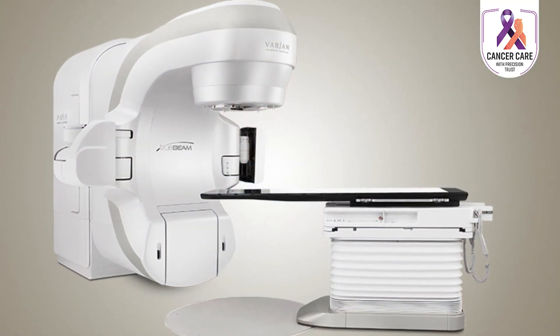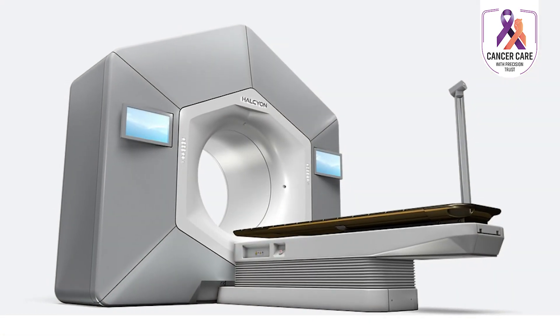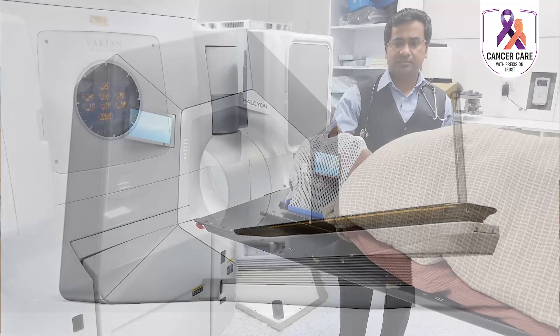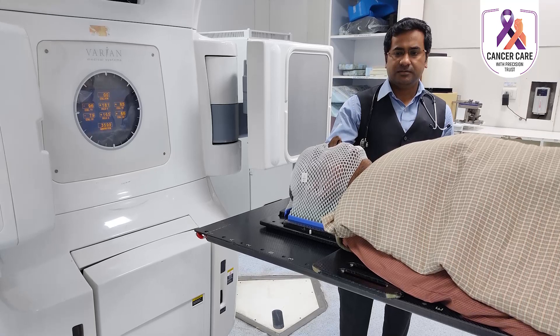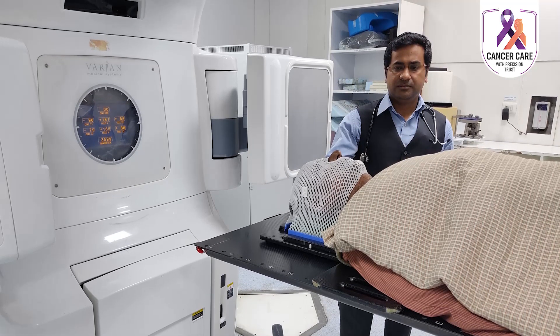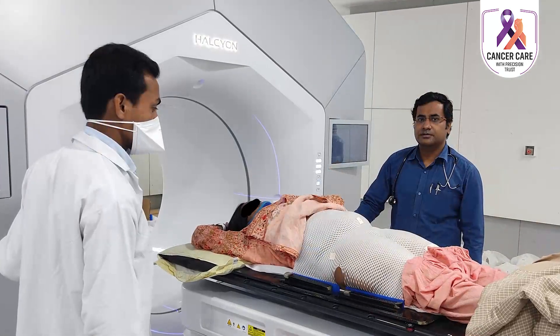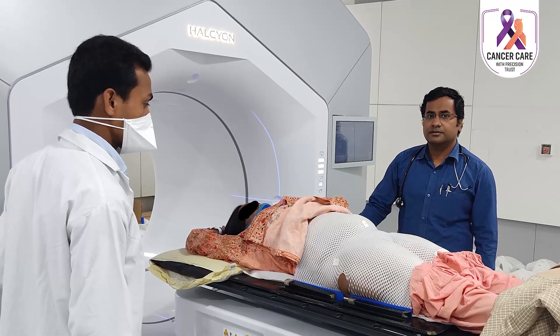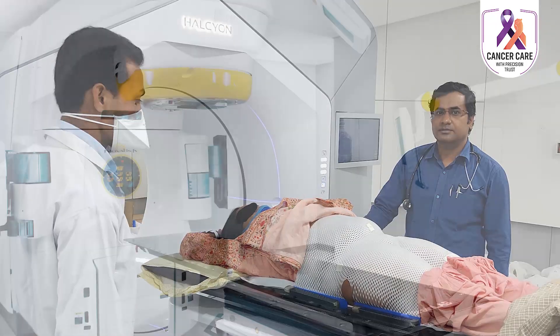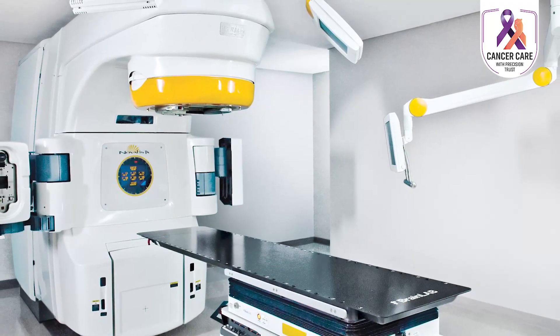Once the plan is done, the patient is taken to the treatment room, where a radiation therapist positions the patient on the treatment couch. They often use certain marks on the patient's skin to position and verify the patient's position correctly. Each session of radiation may take 10 to 30 minutes depending on the tumor site being treated.